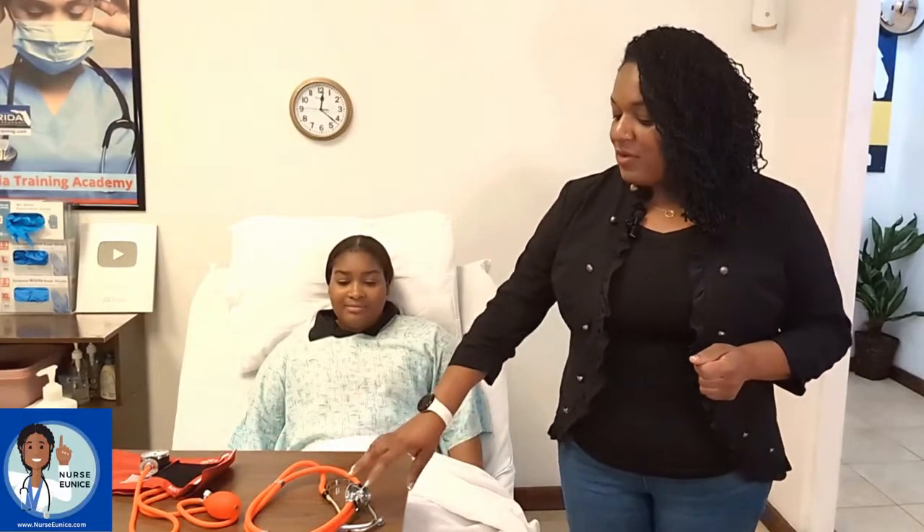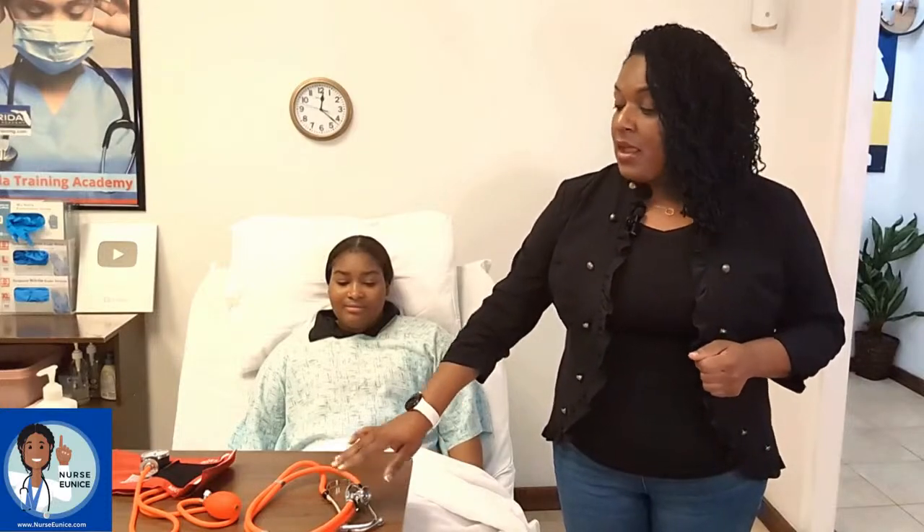One of the first things you want to do is hand hygiene — you want to perform that first. Over here I have hand sanitizer on our station. We also have our blood pressure cuff, which is also called a sphygmomanometer, and then we have our stethoscope. If you're going to be using your equipment for multiple patients, you want to ensure you have alcohol swabs to clean the earpieces and the diaphragm of your stethoscope before using it on a different patient. If you're using your blood pressure cuff on multiple patients, you want to make sure you also have wipes to clean and sanitize your equipment.